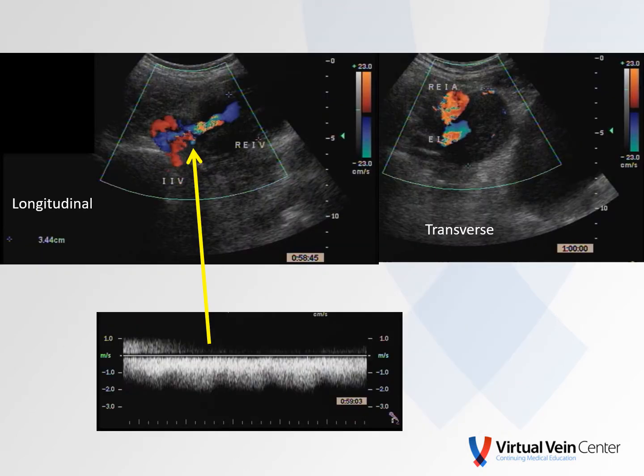So how many of you knew what was going on? The lymph nodes in the groin were kind of the key. And in fact, this patient had a number of large lymph nodes within the pelvis as well. And in fact, here we can see a lymph node largely surrounding or directly adjacent to the right external iliac vein. Look at that fairly continuous flow, velocities near 200 centimeters per second through that stenosis caused by that extrinsic mass.